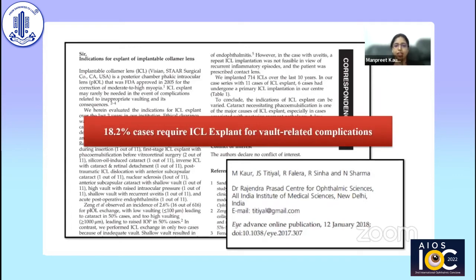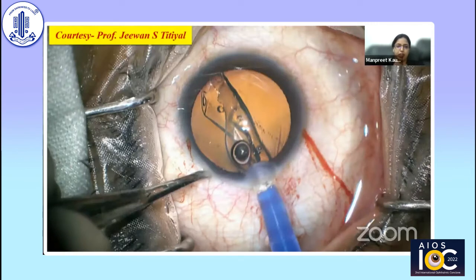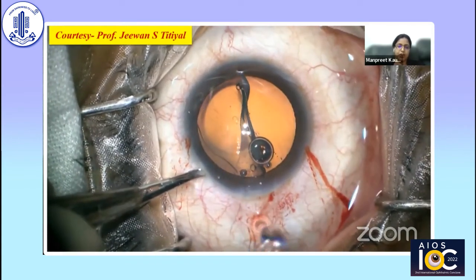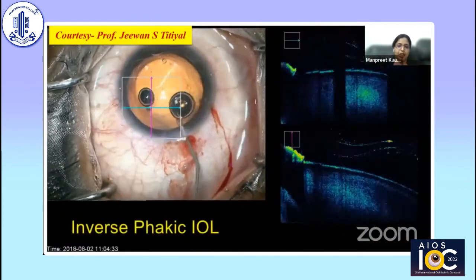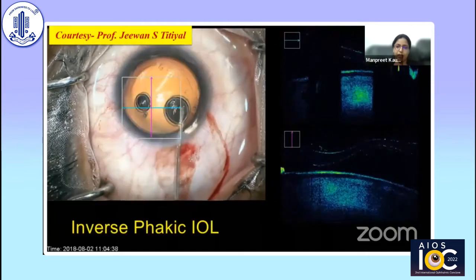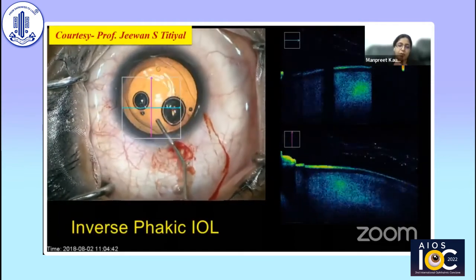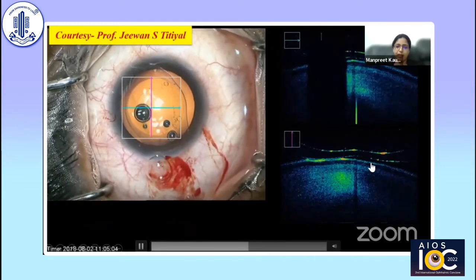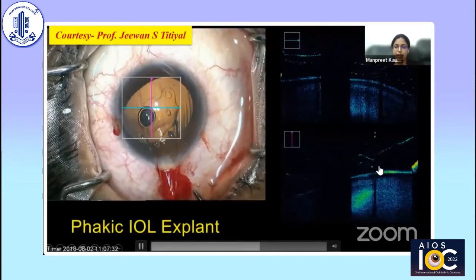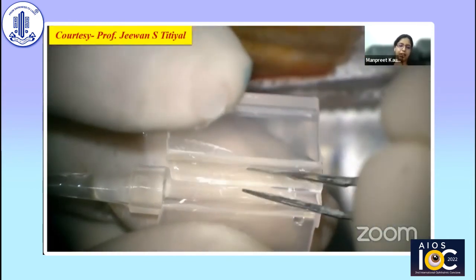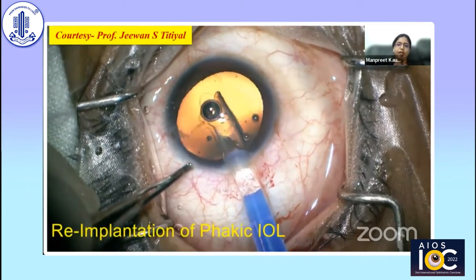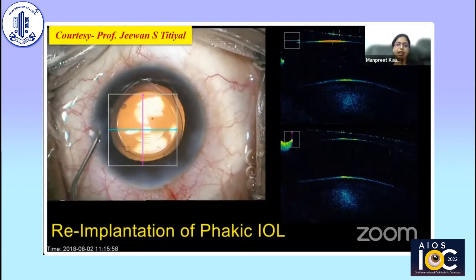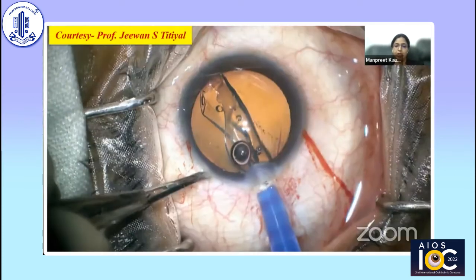Here is a case in which an implantable phacic contact lens (IPCL) was inserted in reverse orientation, visible on intraoperative OCT. These lenses are more flexible than ICLs, making it difficult to assess orientation without intraoperative OCT. Central contact was confirmed, so a decision was made to explant the IPCL on the table, reload, and re-implant in the correct orientation. Had it been left, there would have been a higher incidence of cataract requiring secondary intervention. Intraoperative OCT enables on-table detection and correction, minimizing potentially dangerous complications.